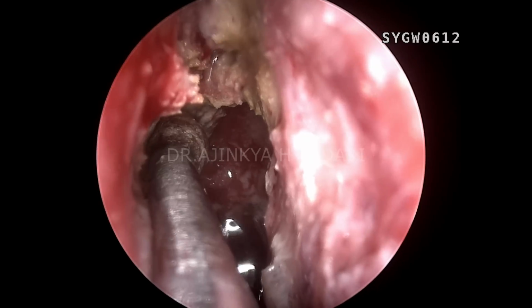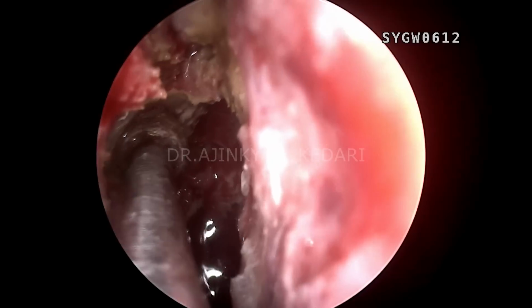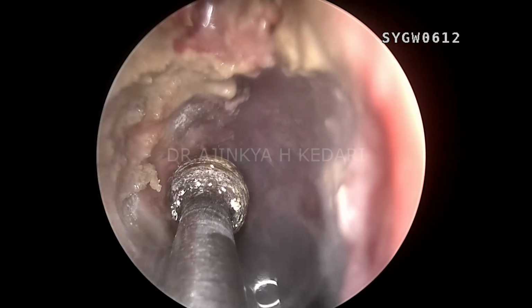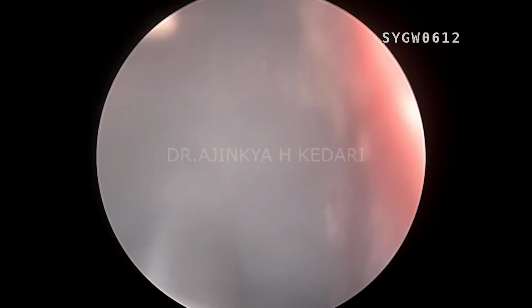And I can cross confirm that by putting my finger on the patient's external aspect and feeling the burr as such with a finger. So I keep drilling the bone. The outer limit should be the skin laterally. The outer limit should be skin superiorly. Always remember that. So keep drilling till you get the skin laterally and superiorly.